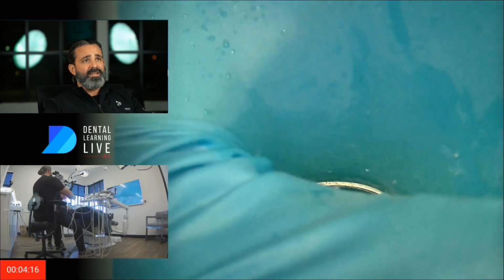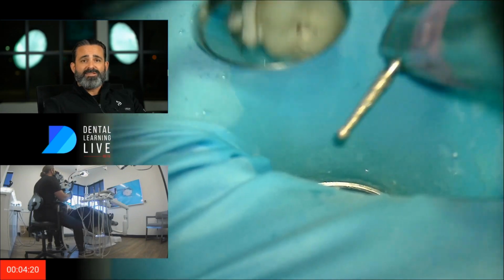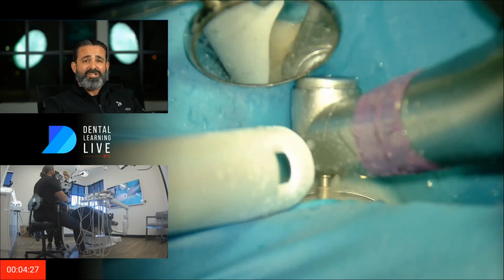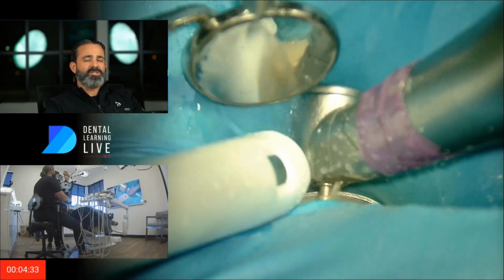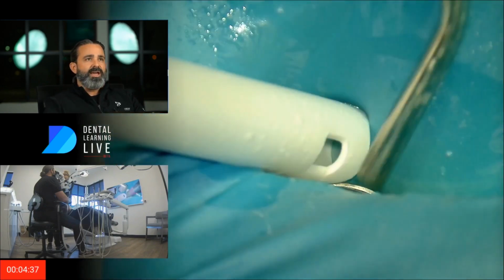We isolated it and recommended a retreatment, and the point is, can the GentleWave make up for good endo? By good endo I mean there weren't any iatrogenic errors. I have no knowledge of who did it. The patient couldn't remember if it was a generalist or a specialist. She thought she was referred, but had nothing more to say than that.